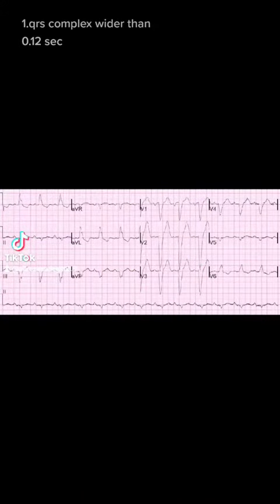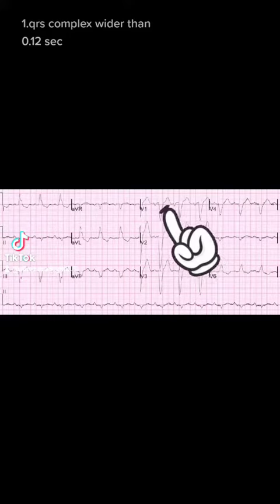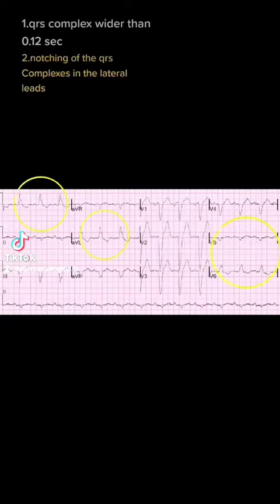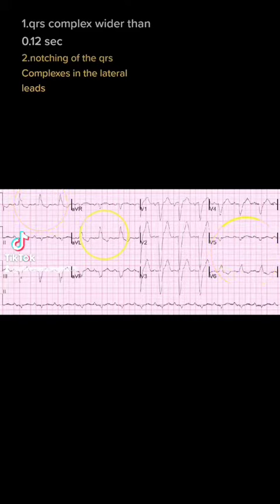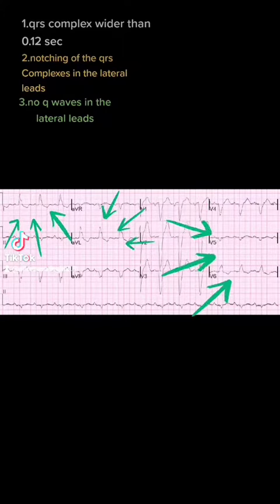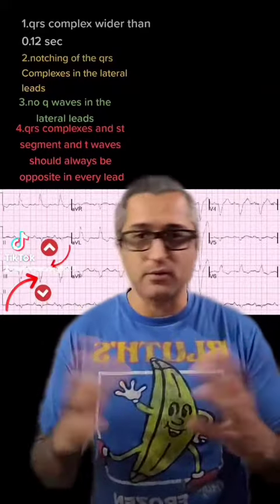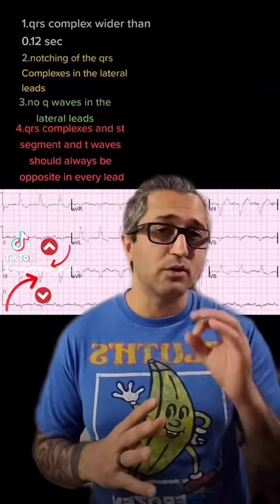The characteristics of a normal left bundle branch block are a wide QRS complex in leads V1 and or V2 that is longer than 0.12 seconds in duration, notching of the QRS complexes in the lateral leads, as well as the absence of septal Q waves in the lateral leads. Also, the QRS axis and the T wave and ST segment axis should always be opposite of each other. Anything outside of this is Sgarbossa's — meaning an abnormal left bundle branch block.